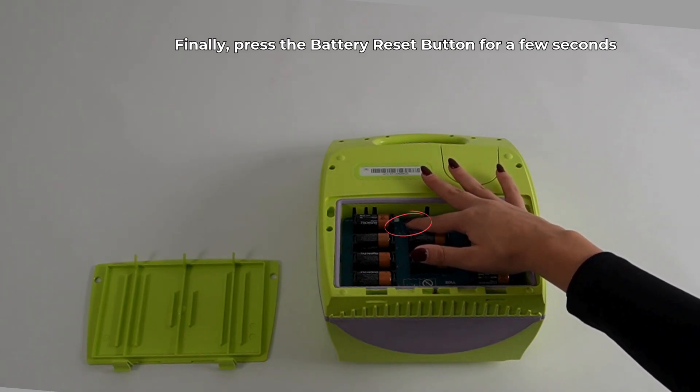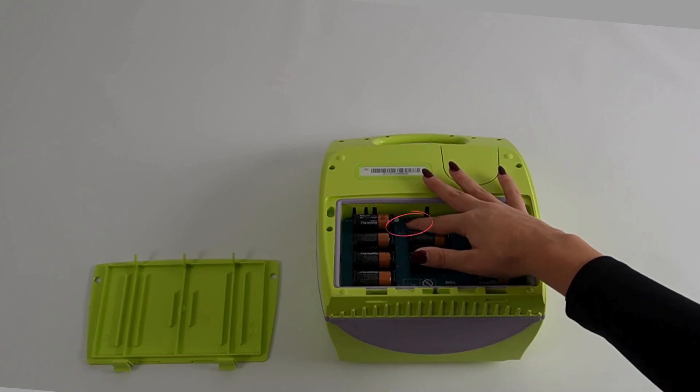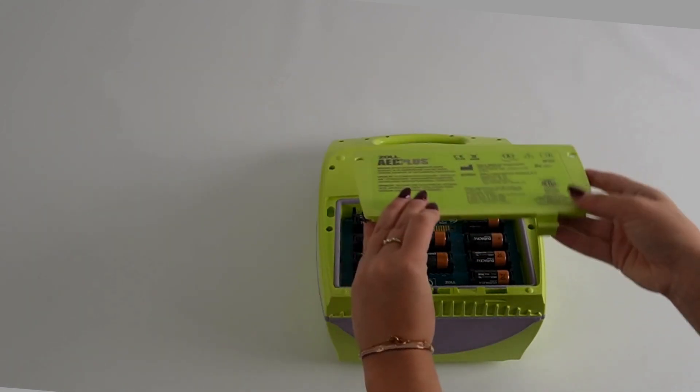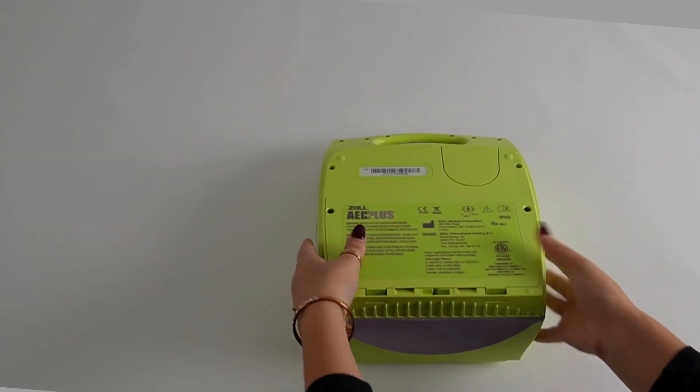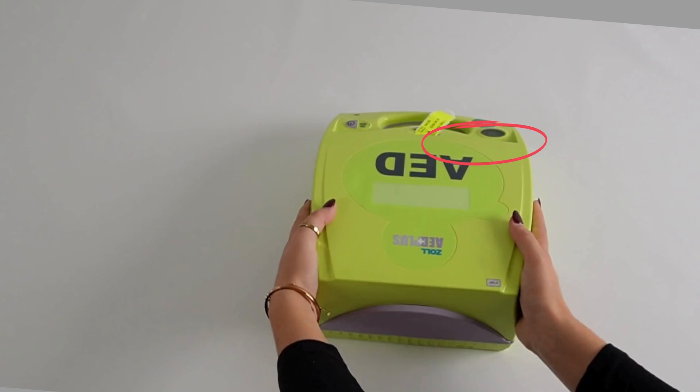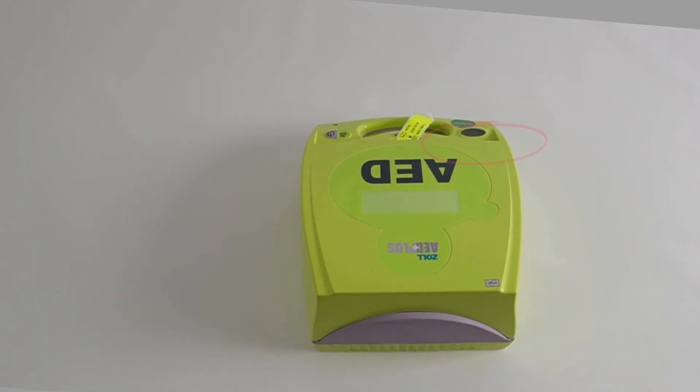Finally, press the battery reset button for a few seconds. When the green checkmark in the upper right corner is visible again, the AED is ready for use.